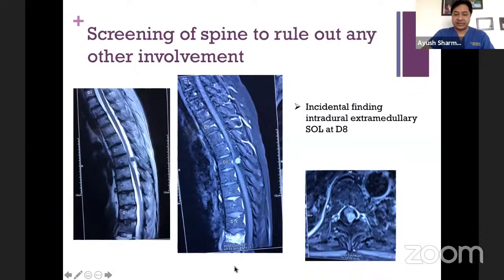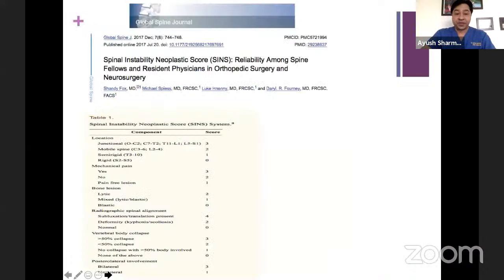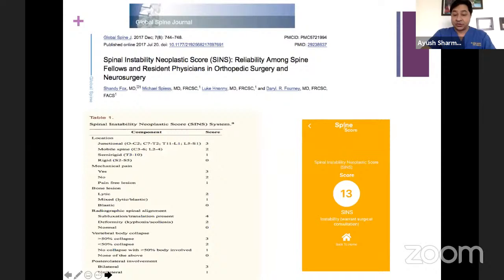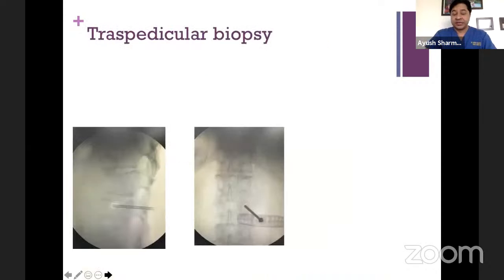And you can see the axials here. Now, interestingly, when we went through the literature, we got a case report that it could be a metastasis from esophageal adenocarcinoma, which has been reported. So that was one more piece of information. We looked at the instability score and it is 13, so we knew that something has to be done. We went ahead with a biopsy because in any such case, you do need to confirm the diagnosis before intervention.